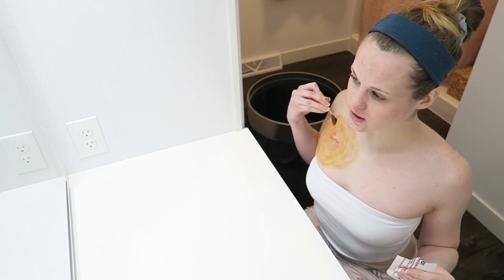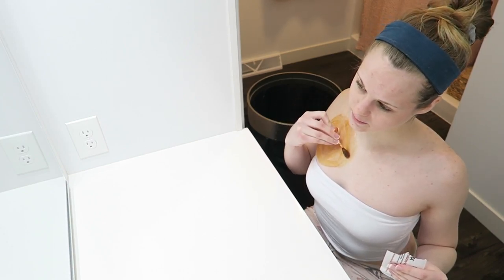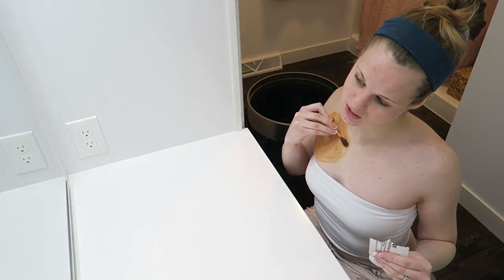And when you're cleaning the area, you want to clean everywhere that the bandage is going to be. So you want the whole area underneath the bandage to be cleansed.